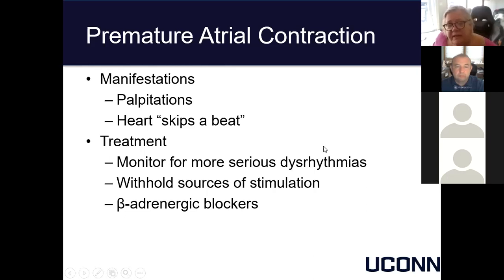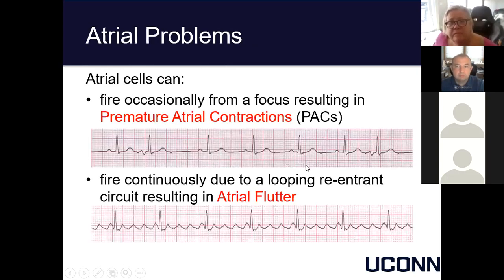But they don't often need much more treatment than that. So again, we know an occasional abnormal focus is a PAC. I should say an abnormal atrial focus is a PAC.